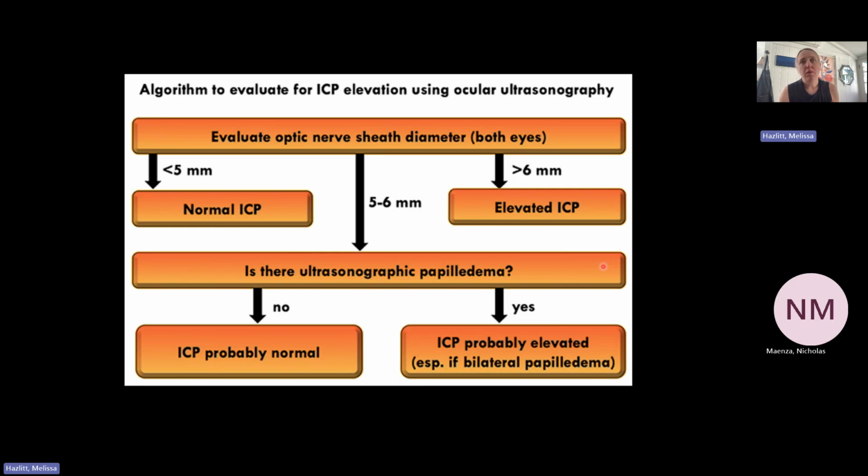That said, let's say you're working in a critical access hospital. They have a CT head, they have some injury, they were polytrauma and you intubated them, but there are some delays in getting them transported. If you're doing these serial exams, you may just have another piece of information to call back your transfer center to try to expedite their movement to the tertiary center.